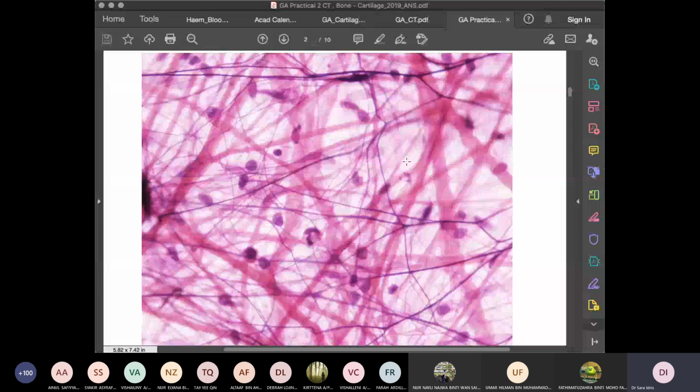Now you have to identify between the fibrocyte and fibroblast. It's slightly a bit difficult. The fibroblast is going to be a bigger cell because it's active. The fibrocyte is quiescent, so it's an older cell. It will be in retirement, but the fibroblast will be bigger. It has a fusiform shape. Sometimes you can see the cytoplasmic processes, and it will have a large and oval nucleus.